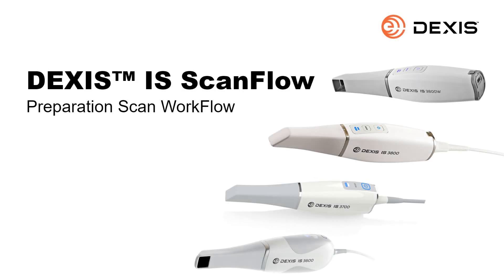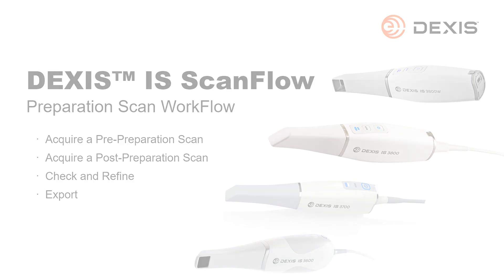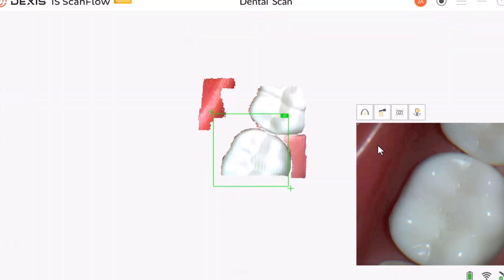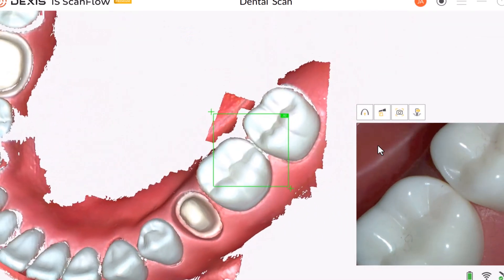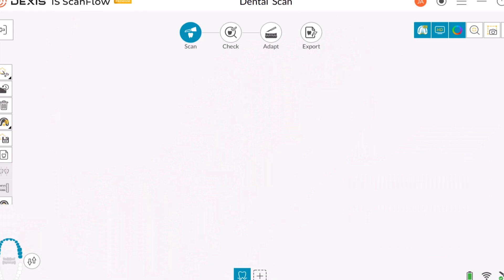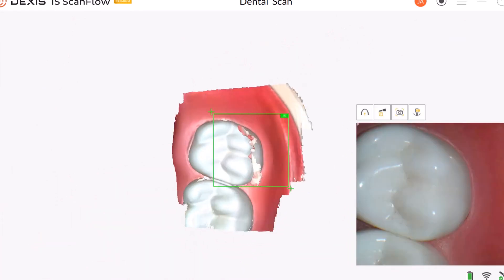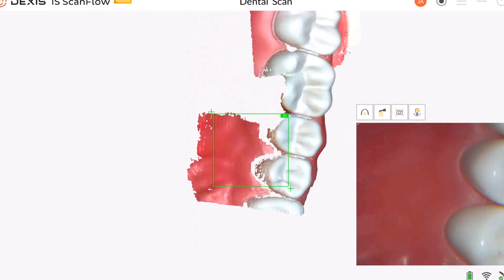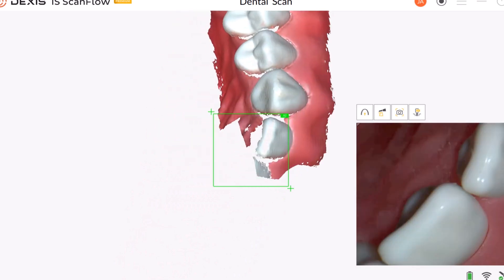This recorded class is designed for clinical team members. It provides the steps to use the preparation scan workflow for a restoration. The preparation scan workflow steps are to first take a new scan, next prepare the area for restoration, then take another scan of the preparation area. Use the preparation scan workflow in cases where the final restoration matches the existing tooth.